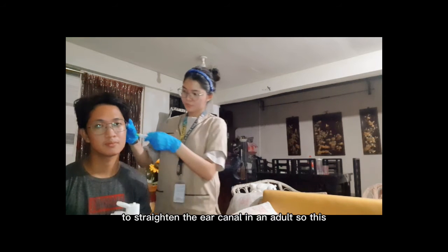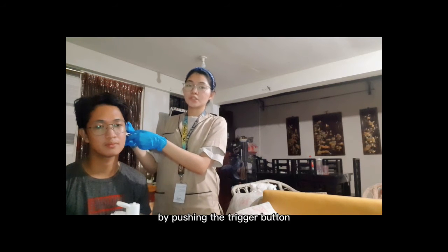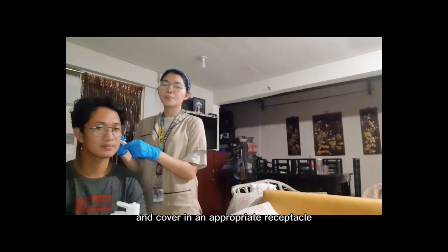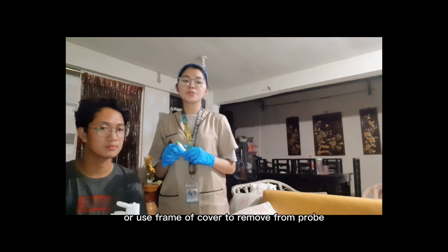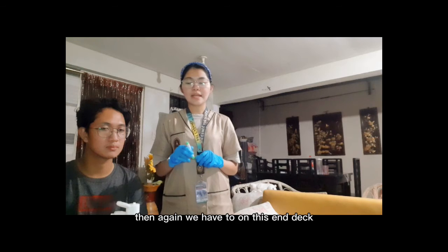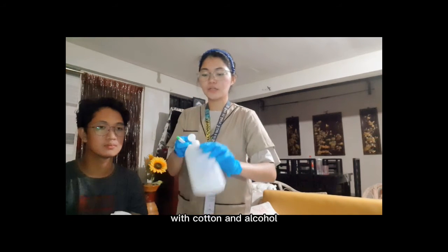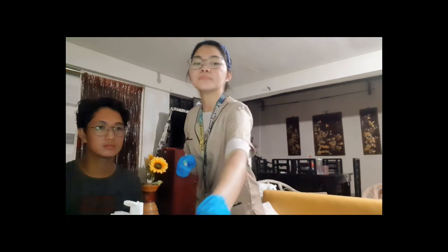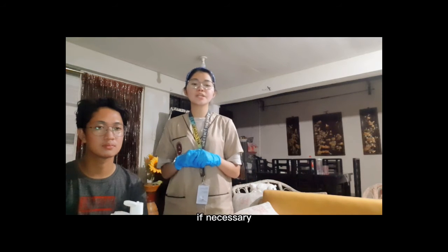So, sir, we have this. Then activate the unit by pushing the trigger button. So the reading is immediate, usually 2 seconds, and we have to note the reading. Then discard the probe and cover in an appropriate receptacle by pushing the probe release button or use rim of cover to remove from probe. Then again, we have to disinfect with cotton and alcohol. Then after that, we have to return the thermometer and its charger if necessary.